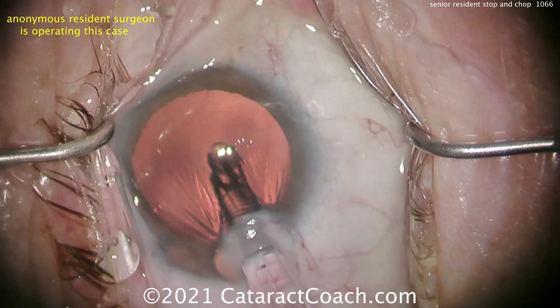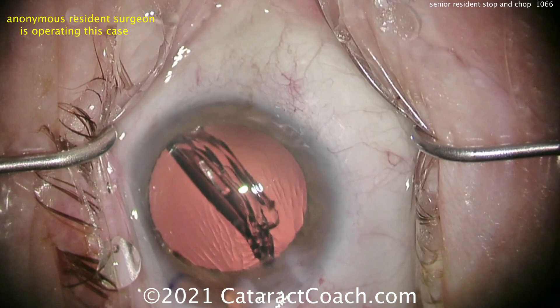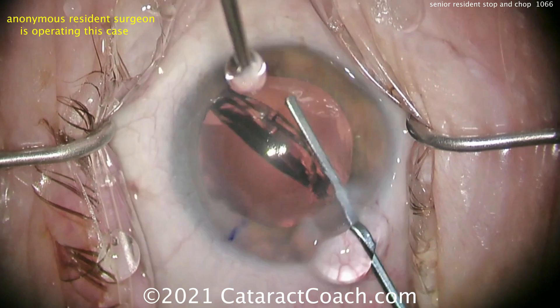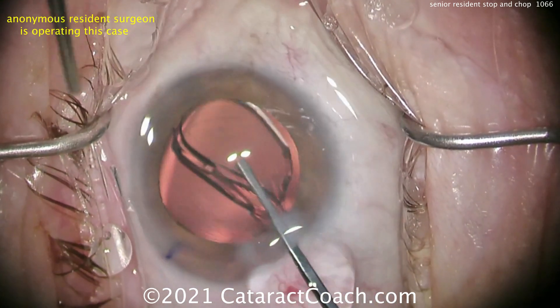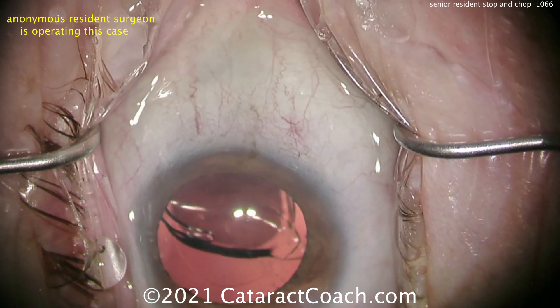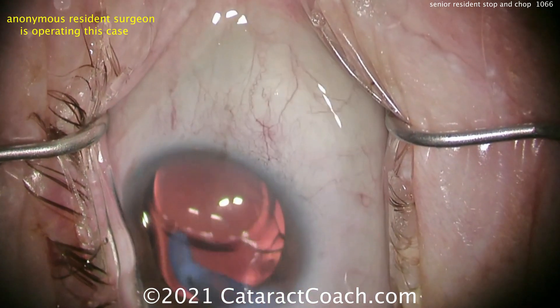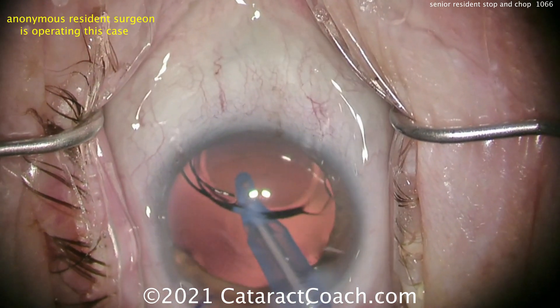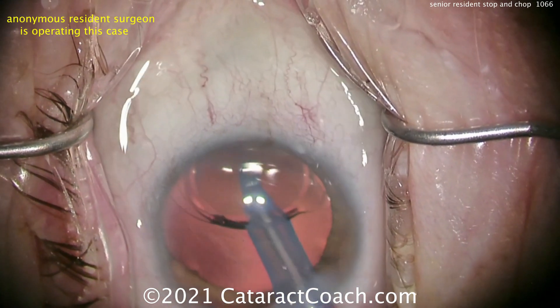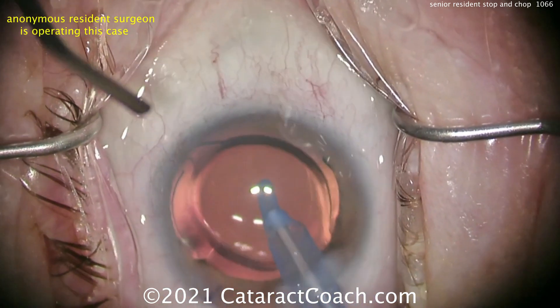Let's see the lens delivery. Here comes the IOL. I'd prefer a chopper in the side port to help fixate the eye and keep it in primary position, but that looks good. Single-piece acrylic lens going in the capsular bag. Looks like a Johnson & Johnson Tecnis lens — I think that is the Johnson & Johnson, looks like a ZCB00 lens, the single-piece acrylic monofocal. That's a good lens. Going behind the optic to remove viscoelastic — very nicely done. Good job, young Jedi Knight.